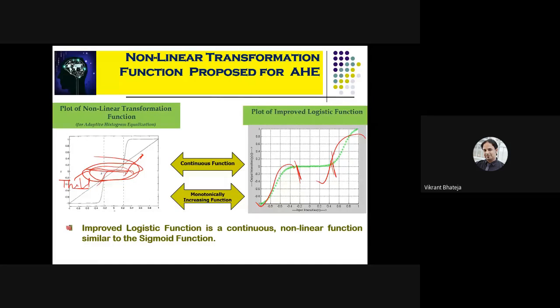If two sigmoidal functions are mathematically combined, we get the connection part, the middle part, which operates as a threshold region, so that pixel enhancement below and above that particular threshold gets controlled. This is how we have changed the function of the existing histogram equalization to this modified function, which is nothing else but a combination of two sigmoidal functions.